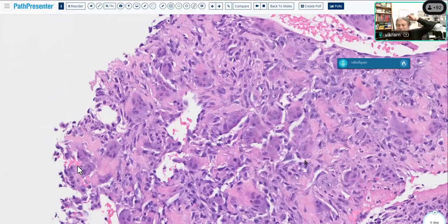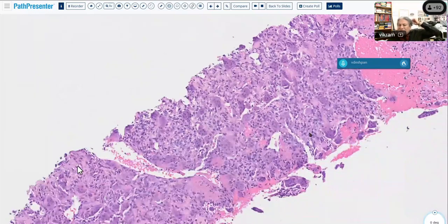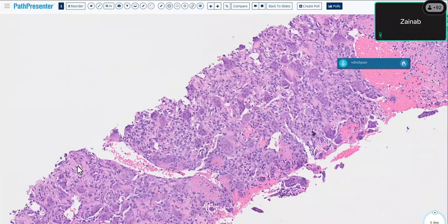So we did USP6, and we sent for USP6 FISH, and there was a rearrangement of USP6. Now, does someone have a suggestion? It's ABC, sir. Right. So this was a solid ABC. It's just a challenging one, but that's what we eventually called it, a solid ABC, and that's on the differential. So giant cell tumor of bone, solid ABC, brown tumor. So we covered a giant cell rich osteosarcoma. That's the differential diagnosis. Is there something else I missed?